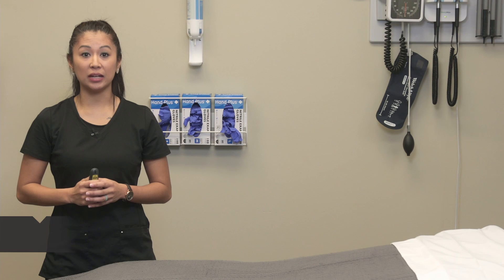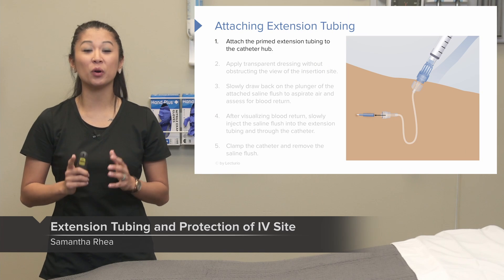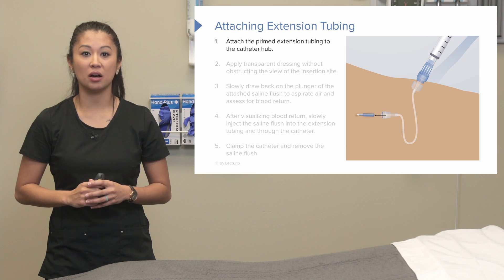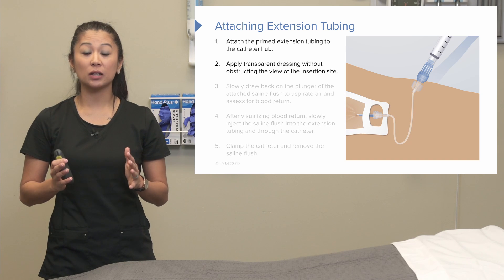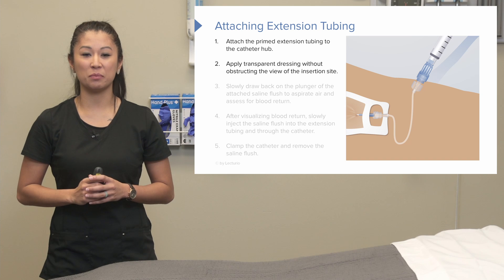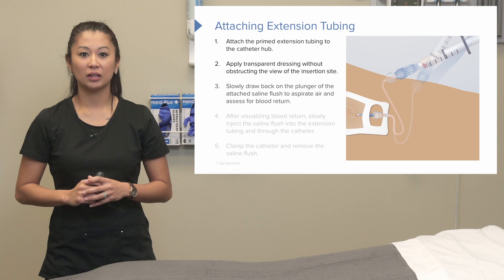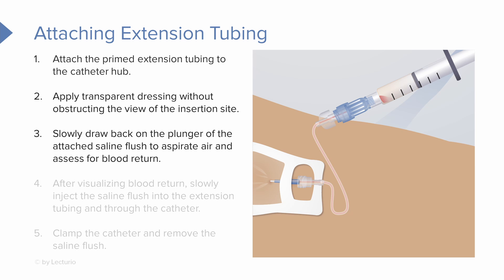Now that we've inserted the IV, let's look at how we attach the extension tubing, or if you remember, the pigtail. Attach the primed extension tubing to the catheter hub. We're going to apply our transparent dressing without obstructing the view of the insertion site — this is really important, we need to see where that catheter went in. Now slowly draw back on the plunger of the attached saline flush to aspirate, or pull back, and see if we have blood return. This will let us know if we were successfully in the vein.